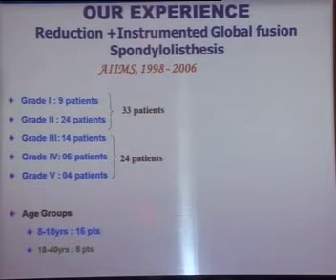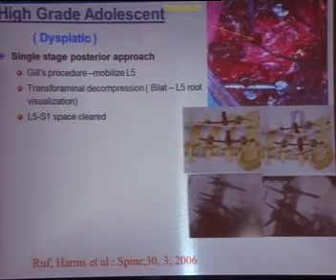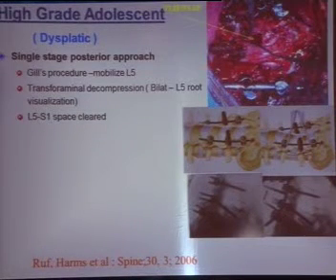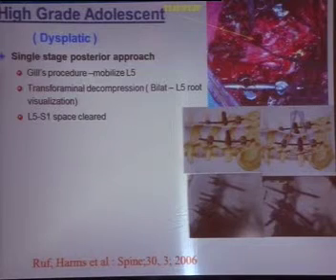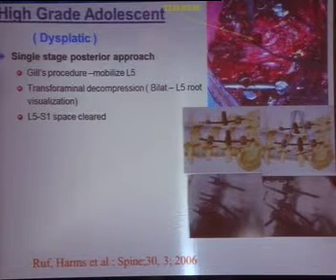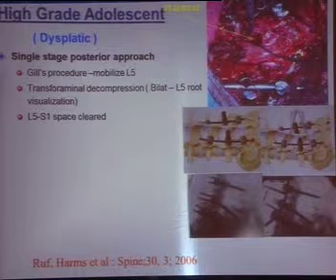Our own experience, we have been doing it since the late 90s, 24 patients. Many of them are in the younger age group, but some of them come late with very severe leg pain, and in the middle age group also, and they need to be treated. Well, we do a wide decompression, a Gill's procedure. And we use the Jurgen Harms technique. We go to L4 and L5 and S1 fixation, and we use reduction screws. You can use any reduction devices, and there are lots in the market, very sophisticated devices.